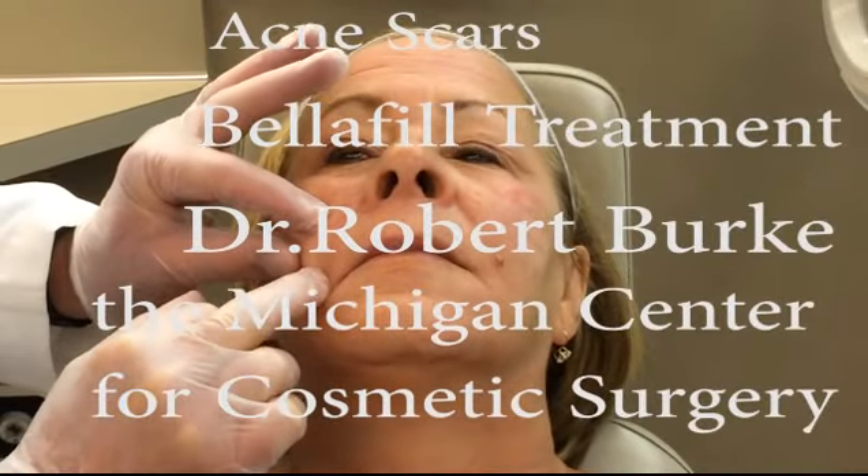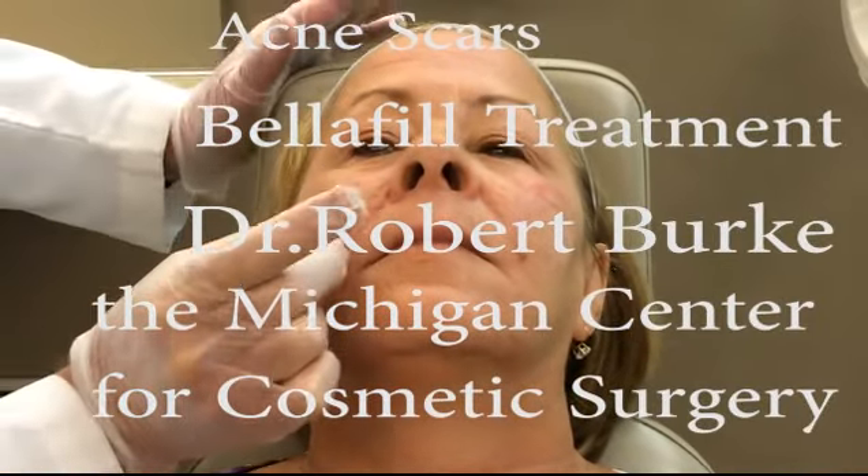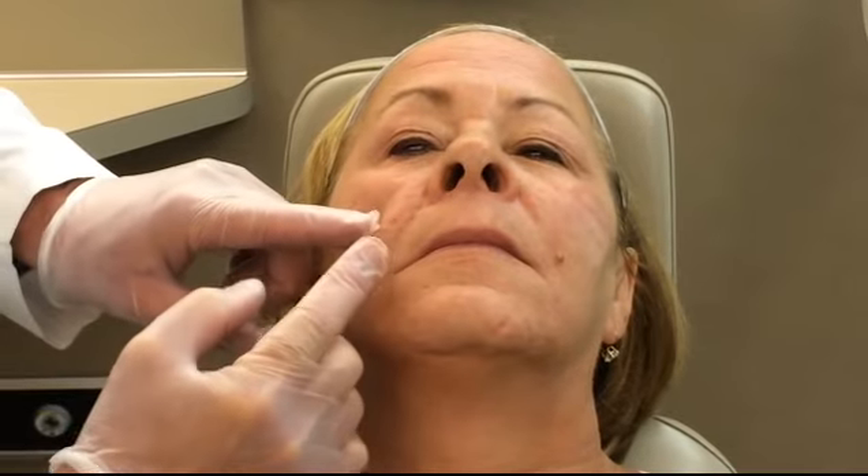This is Porter. We're going to start treatment on these really bad areas here. We're going to start on this right cheek area here. The thing is that when I push on this, it's what we call distensible — so that means I can raise it up from the bottom.